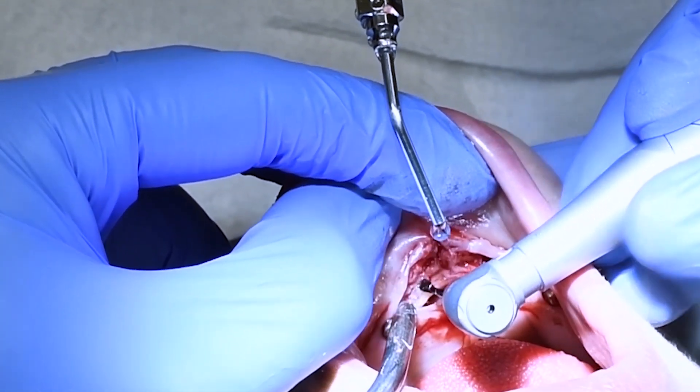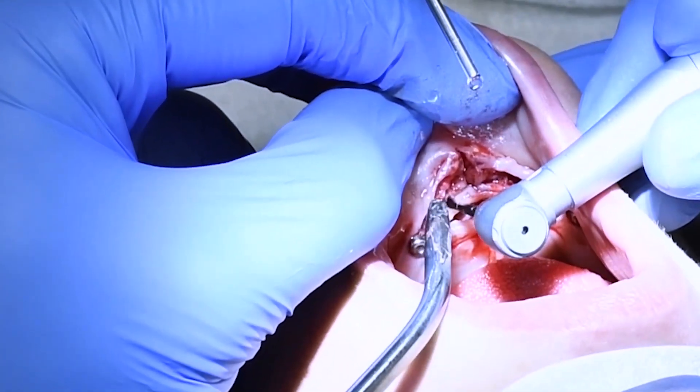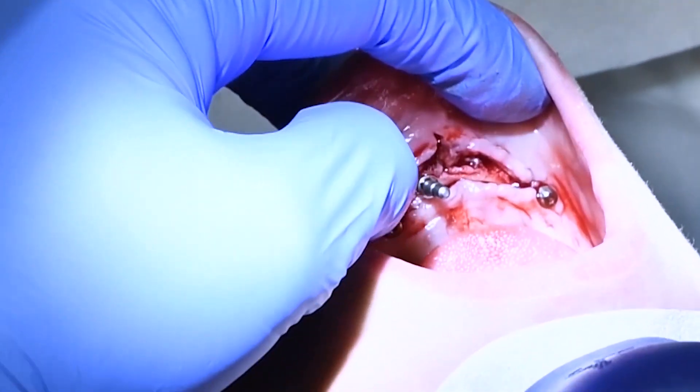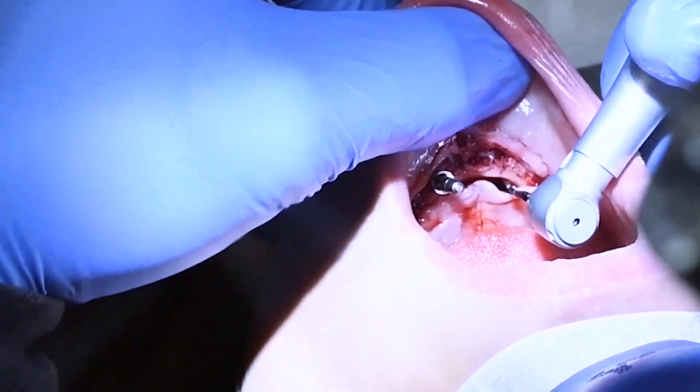In between the two implants that you can see currently in place, we want to place two new implants. This is the pilot drill. I'm using the lingual bone on the inside to make sure that I'm parallel, straight, and at the right angle.